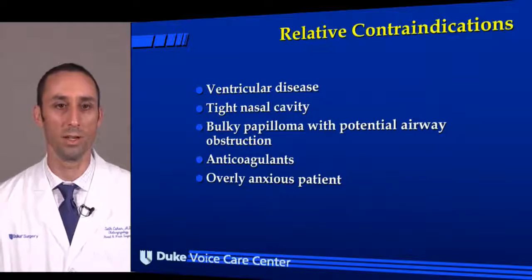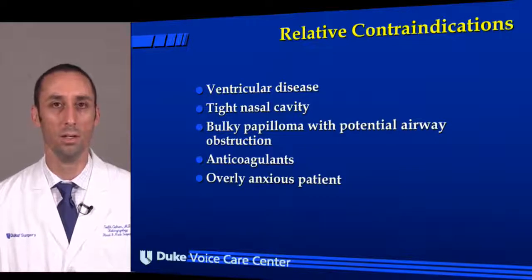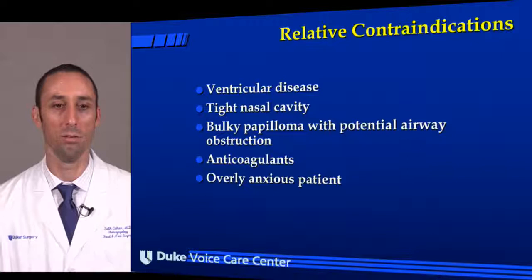This is almost never a contraindication, but a very tight nasal cavity. Again, these scopes are a little bit larger, but I've never had somebody where you could not pass that through. If you had really bulky papilloma with potential airway obstruction, such as in that child I showed you, that would not be a good indication for treatment in the office.